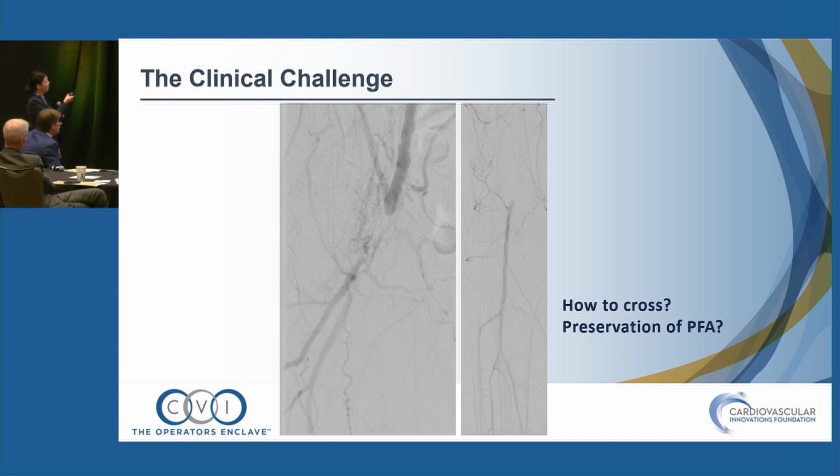The occlusion starts essentially at the site of the endarterectomy. You would anticipate that it's probably rock hard. There's some reconstitution of the profunda. Profunda is also occluded. The SFA is occluded. And you have essentially a blind pouch, and then all the way into the reconstitution in the popliteal segment.